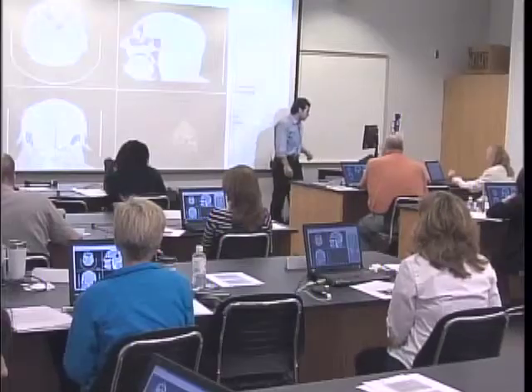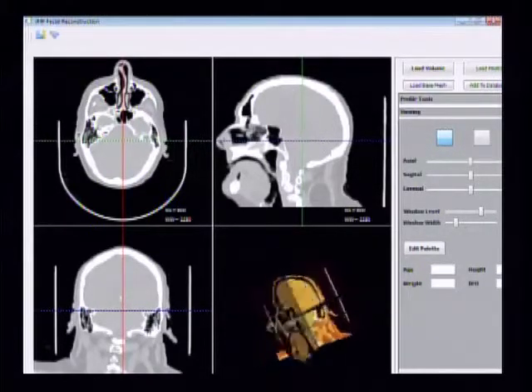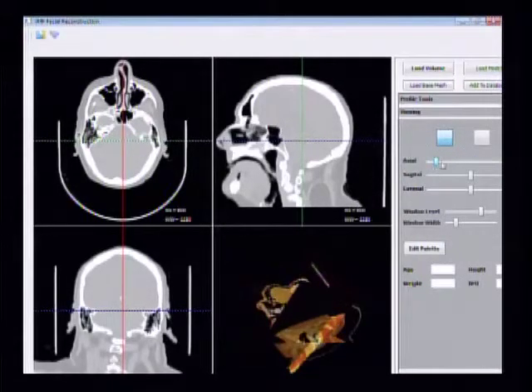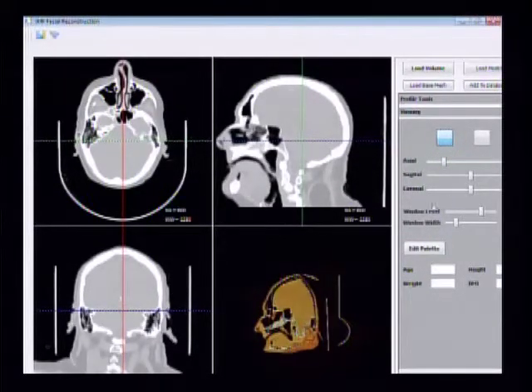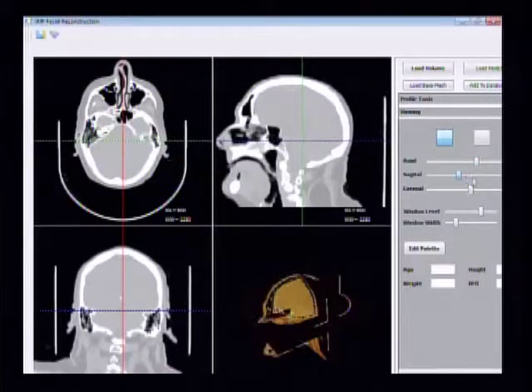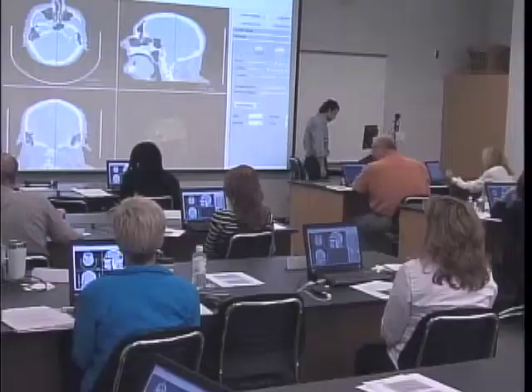and you can see how it changes your rendering of the image. Do you see that? This 3D viewer gives you an option to see the slices registered together, and this allows you to see some of the anatomical features in the volume, and you can manipulate each view by changing the slider corresponding to it. So you can move this axial slice up and down, and you can look at the features by moving the axial slider. And you can move the sagittal the same way as well, and you can see how it's registered with it. So this is one viewing mode.